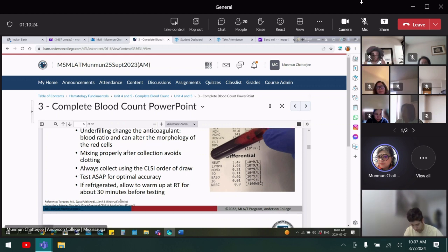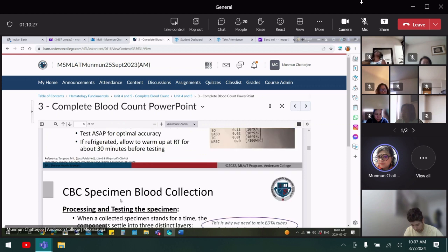So basically, that's why I'm telling you about the difference between SST and PST. But when you are doing the work in our lab, to not waste your blood, you can draw any one of the tubes. But you have to keep it in memory and write it in the note. For theory purposes, for ML purposes, you are going to do the SST. When you go into the professional field, they will tell you what you have to draw. Nowadays the label tells you what you are going to draw, because their LIS, lab information system, from the lab is going to give you the guideline.